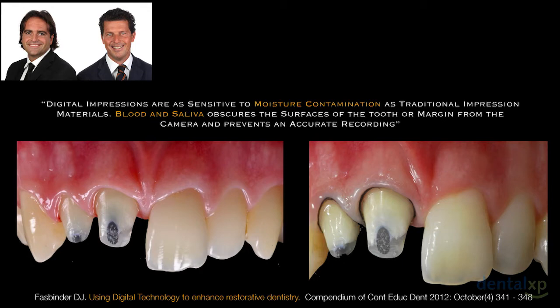This doesn't change. We need to have pictures and the patient looking like this at the day of our final impression, because we want to be as accurate, as precise and as predictable as possible for our patient.